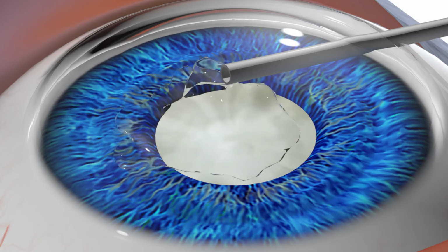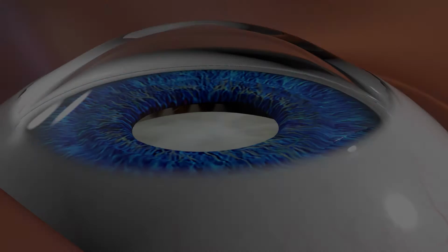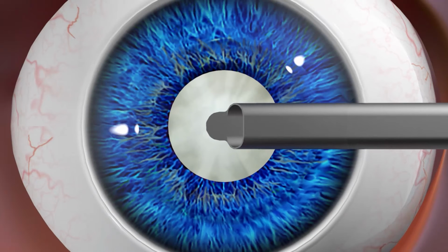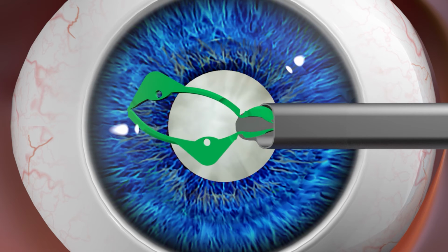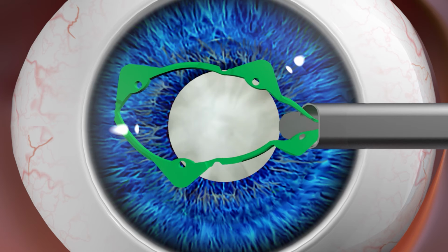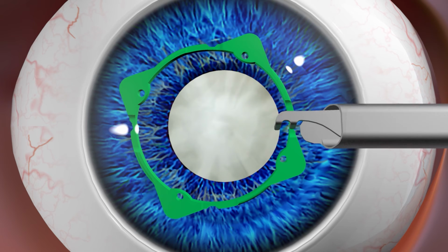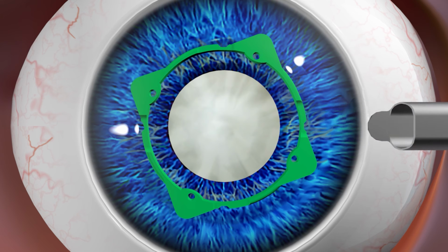After injecting viscoelastic into the anterior chamber, introduce the inserter through the primary incision, positioning the tip of the cannula centrally over the lens. Inject the iRing above the iris by gradually moving the slider forward while simultaneously withdrawing the cannula to allow the ring to be placed centrally. Completely retract the prongs prior to withdrawing from the primary incision.